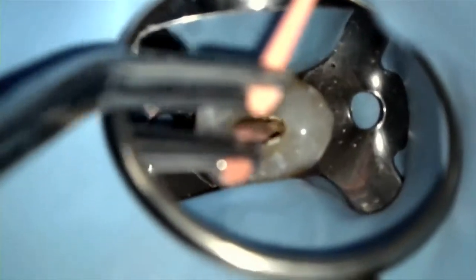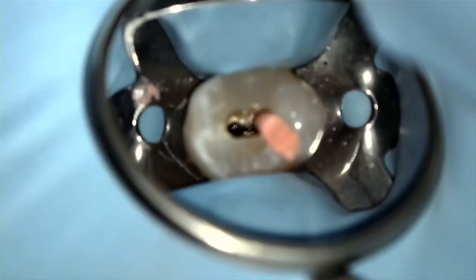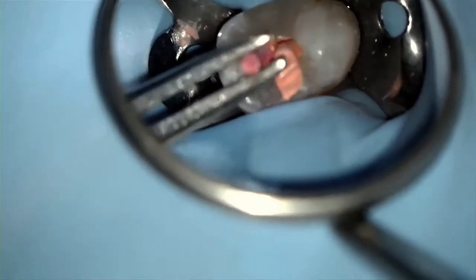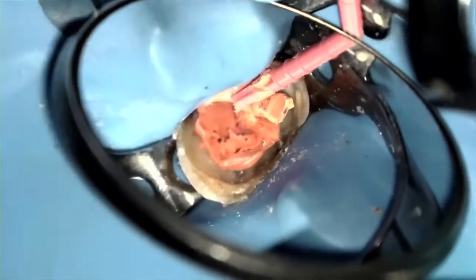As shown in the video, in ovoid or large canals, I personally like to place a single master gutta percha point, corresponding to your master file, at one side of the canal, leaving space for the gutta core that will be inserted alongside it. To improve visibility and reduce interference with the warm gutta core, I suggest cutting the cold gutta percha at or below the occlusal table. This is optional, but in large canals I like to down-pack the warm gutta core gutta percha around the cold gutta percha in order to provide an even better obturation.